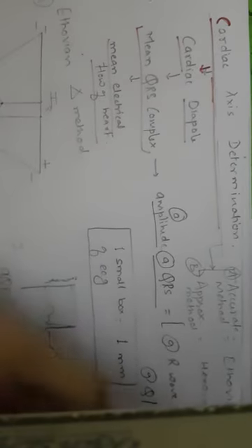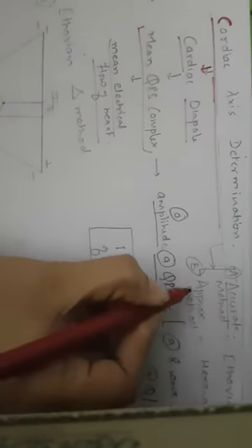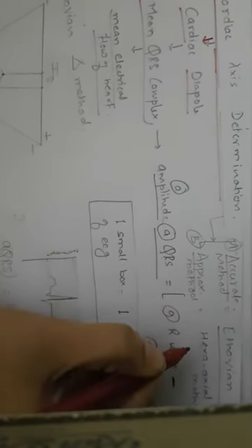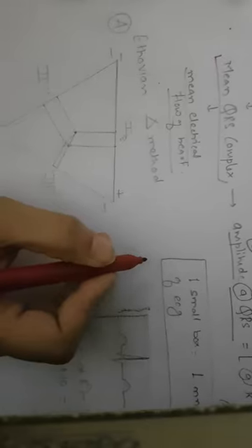The average thing. Okay. So there are two major methods. One is the accurate method and the other one is the approximate method. The accurate method is by using an Einthoven triangle and the approximate method is by using the hexaxial method. Okay, so first of all we'll see the Einthoven triangle method.